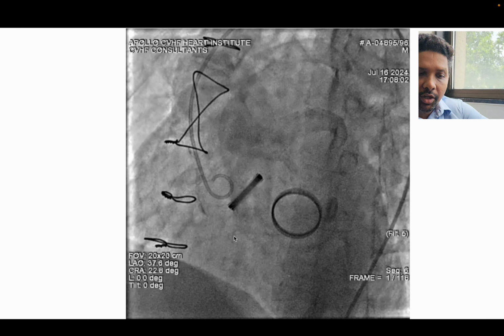And as this is a very important step, as you see, the Terumo wire actually goes from the tip of the JR in an oblique fashion below the aortic valve and then enters the LV. This is the direction of the leak, and the wire will follow the direction of the leak, which is very important to understand. If you try to poke in some direction thinking that there is a leak and the wire will go, you will have a lot of problems. The direction of the leak is below the valve in a certain way, which 3D print also showed, even virtual reality showed in a better way, and we followed the track, and that's why we could cross it in a jiffy.